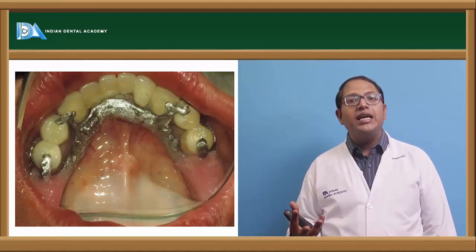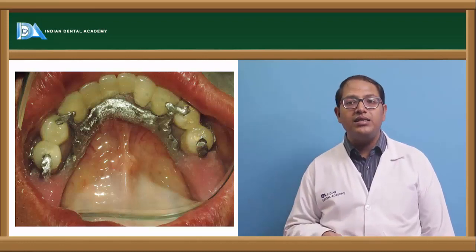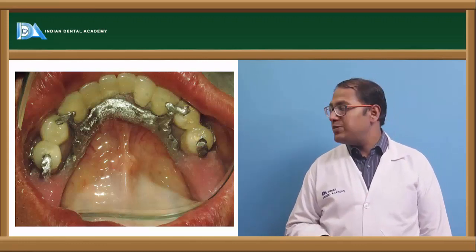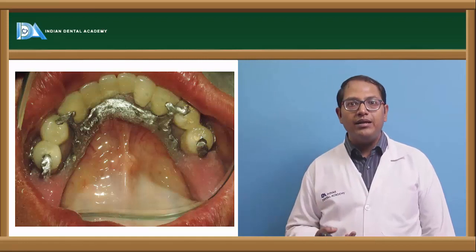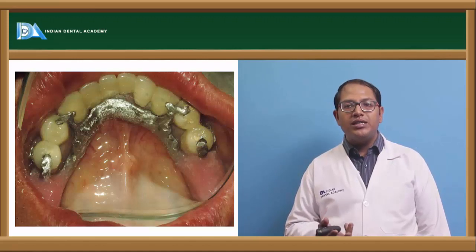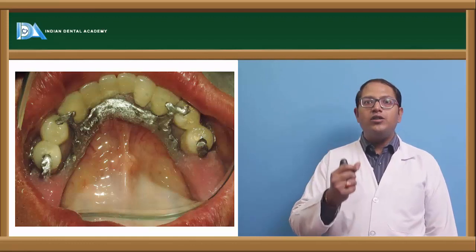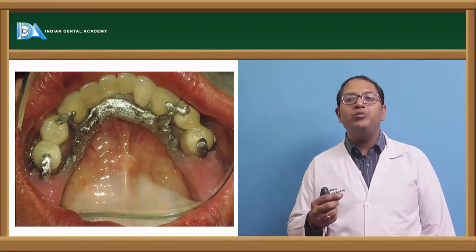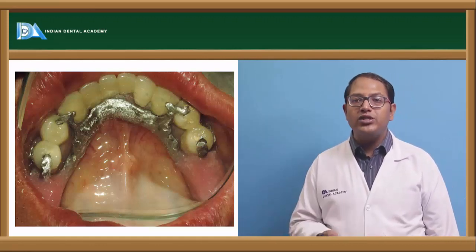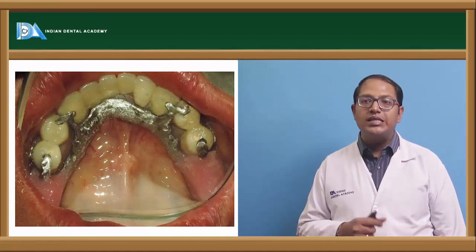But if we are using an acrylic denture base or acrylic resin, the use of a characterized acrylic resin to duplicate the soft tissue tones of each individual patient can permit aesthetic placement as well, because metal will be like metal, but when we are using acrylic, it can have a little color of the mucosa. That is one of the greatest advantages of acrylic denture base resin: the artificial teeth are also acrylic, so they get very nicely positioned exactly where the original teeth were, regardless of the loss of the ridge or whatever may have occurred. The restoration part becomes easy when you are using acrylic resin beneath it.